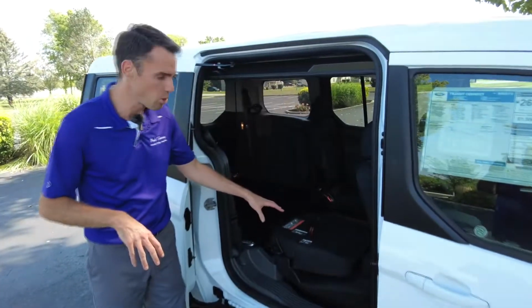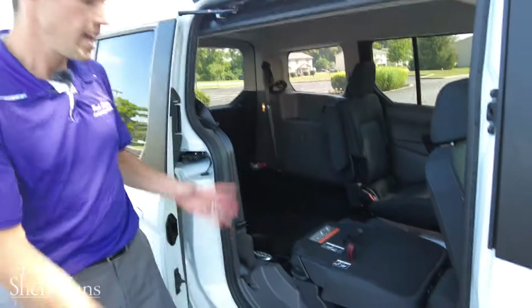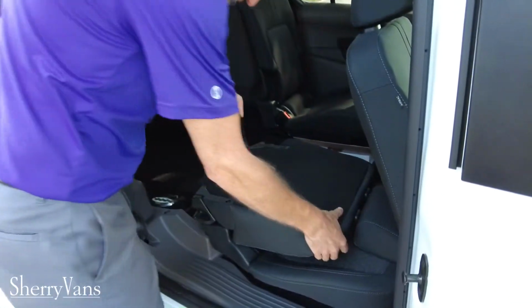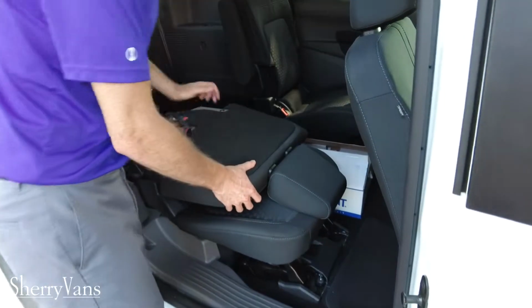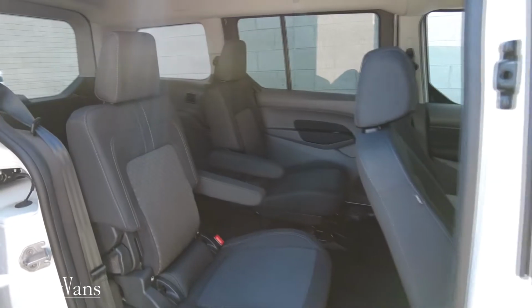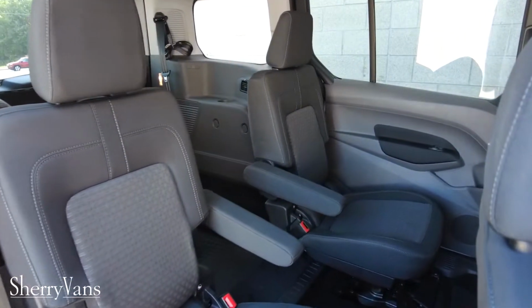You're still able to fold down the seats. Both can be folded down. I have this one in the down position to show you, and it can be folded back up if you need the seat for a passenger. It's easy to do. Pull that, make sure it clicks in, and up it goes. So now you have up to 4 passengers plus the wheelchair passenger for a total of 5 passengers.